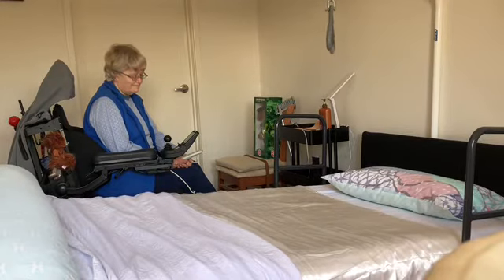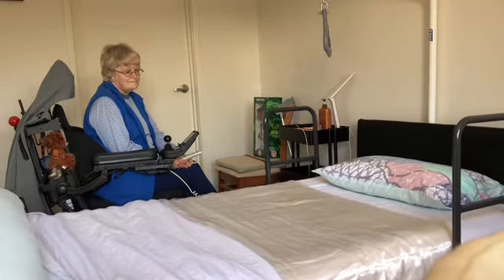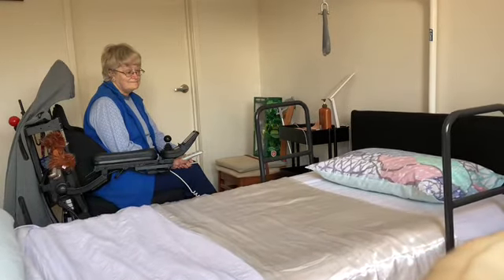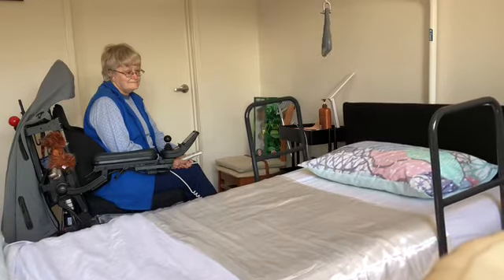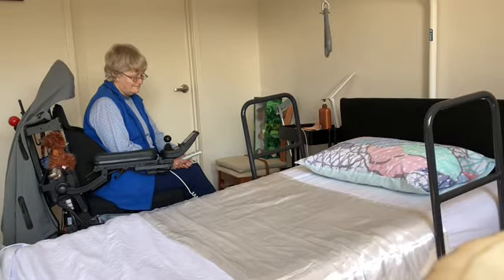The bed can also tilt with head down and with head up, if you have a need for this sort of positioning.